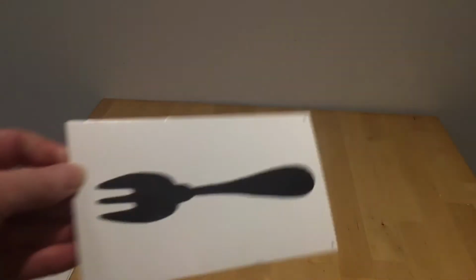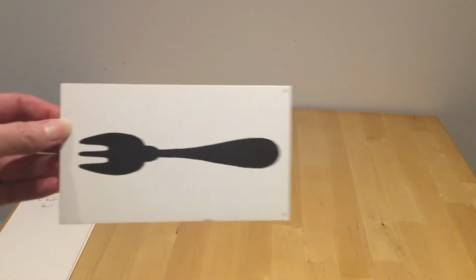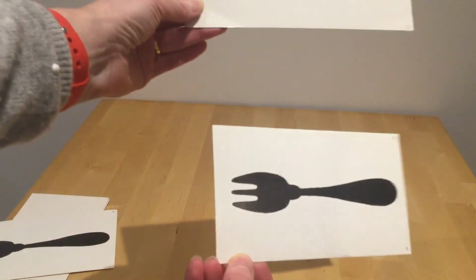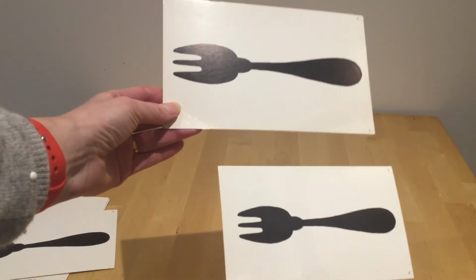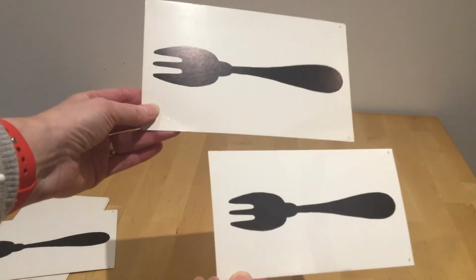However, here is the fork from set 2, and you'll notice if I try and hold up the fork from set 1, there is quite a difference in size, so it's probably best just to do the whole of set 2.